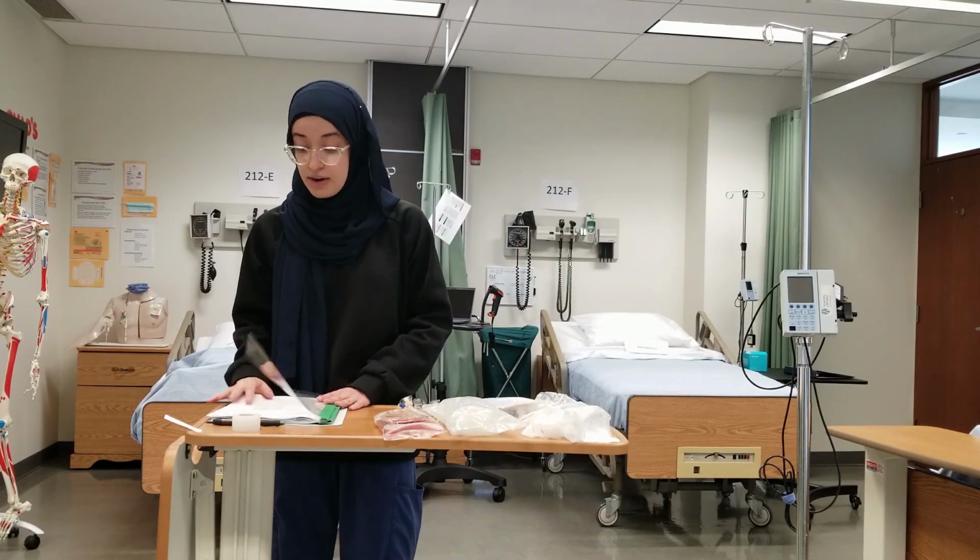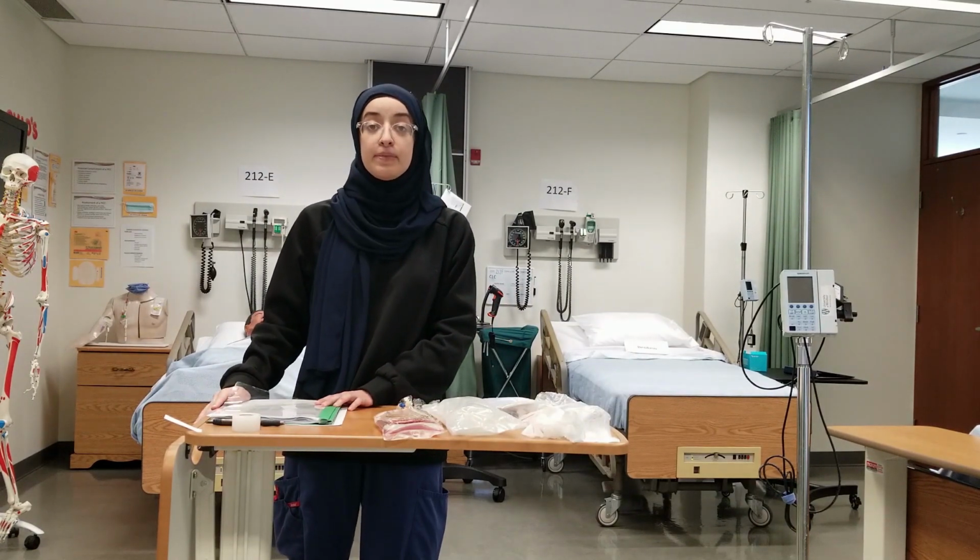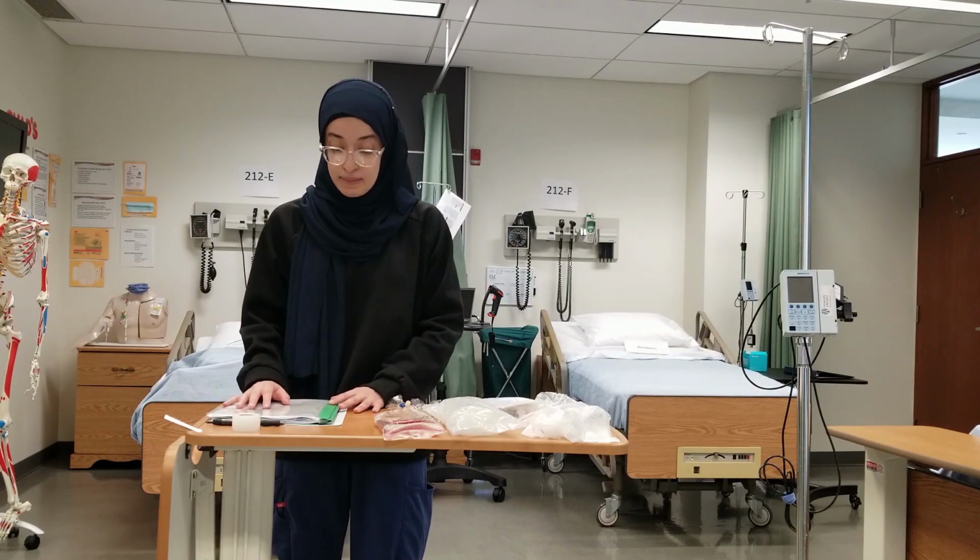So I've checked the MAR. There aren't any medications that need to be given. Then I'm going to go ahead and check my labs.